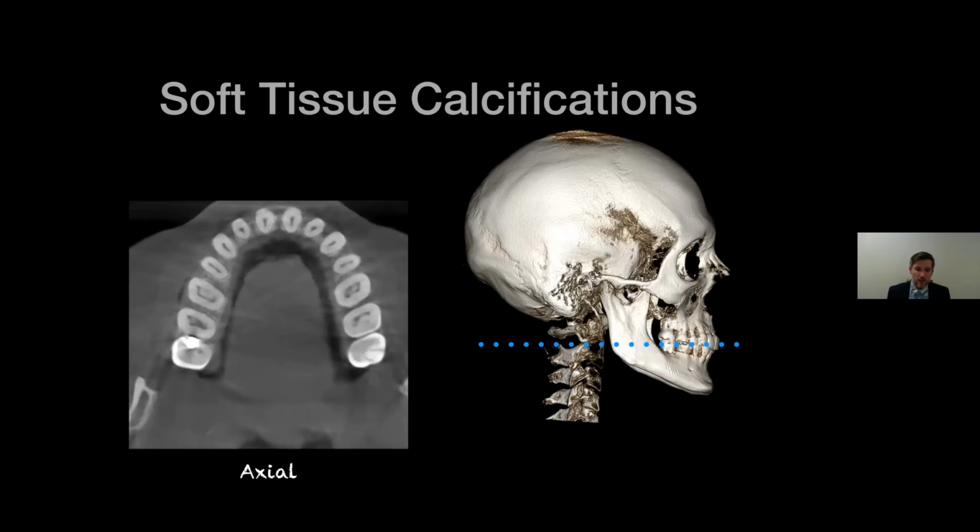So you should be able to get away with taking a low dose, low resolution scan, and the dose will end up being equivalent or less than a pan. So I would say either child settings on a 2D pan, or if you have a cone beam, I would say take a low dose scan.